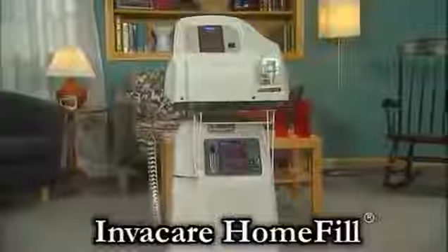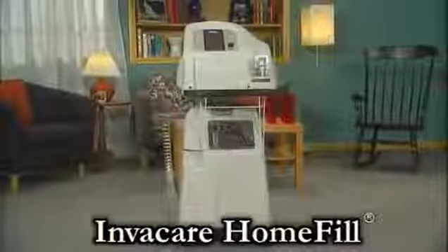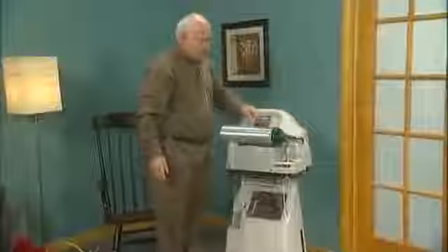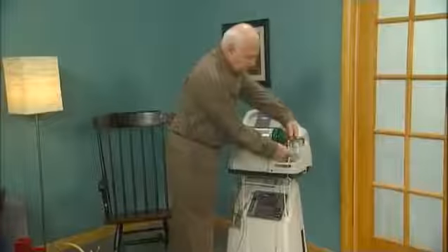The Invacare Home Fill is a multi-stage pump that simply and safely compresses oxygen from an Invacare Home Fill compatible 5-liter or 10-liter concentrator into Home Fill oxygen cylinders. The Home Fill is designed with you in mind and is extremely easy to operate.